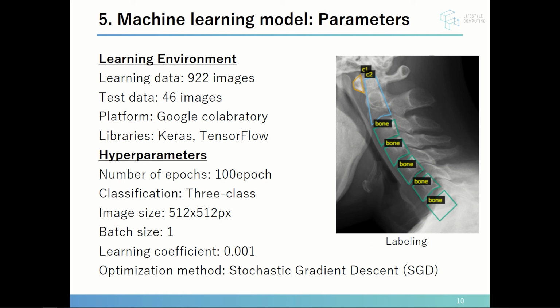The cervical spine regions are masked differently for C3 to C7 and for C1 and C2 because of the special shape of the latter. Specifically, the C1 region is an anterior arch, and the C2 region includes the entire vertebra from the vertebral body to the odontoid process.